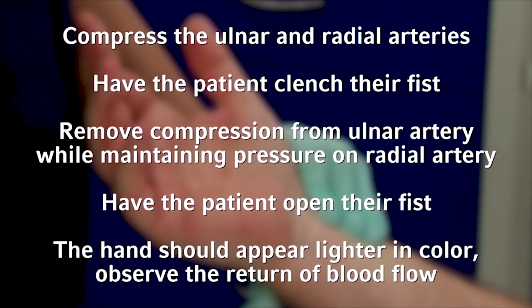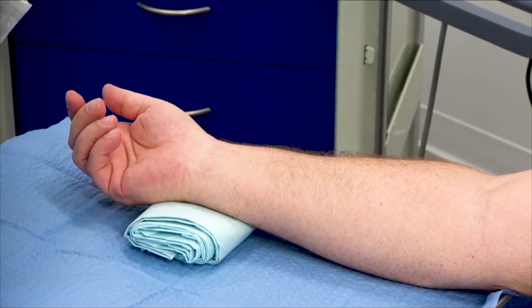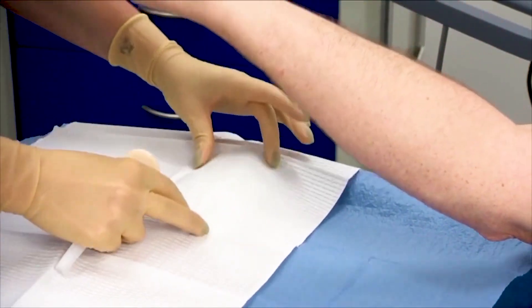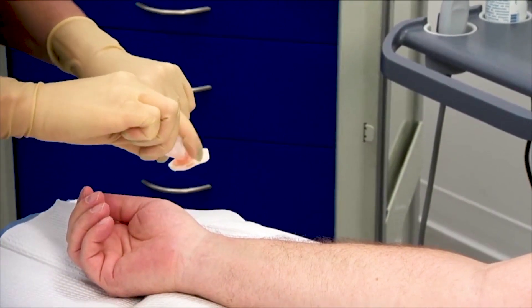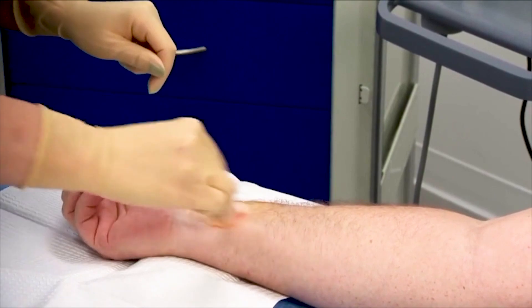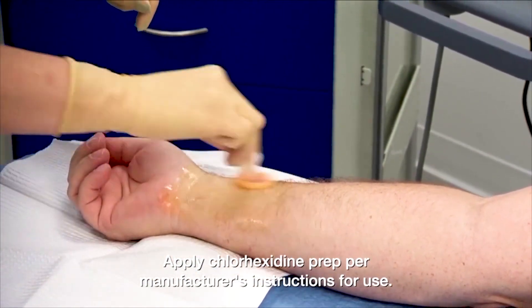Clean the patient's wrist with soap and water. Next, prepare the extremity for insertion. Position the wrist in dorsal flexion to bring the artery in closer proximity to the skin, and secure the hand if needed. Don sterile gloves. Prep the insertion site with chlorhexidine-based skin prep per hospital policy, using a scrubbing motion to create friction. Allow the proper drying time per manufacturer's instruction for use. Now apply a small fenestrated drape over the insertion area.